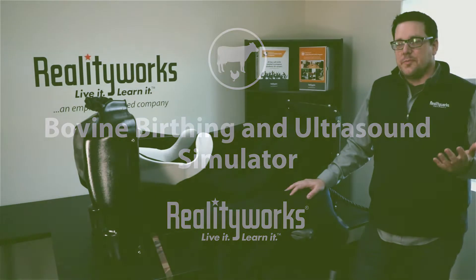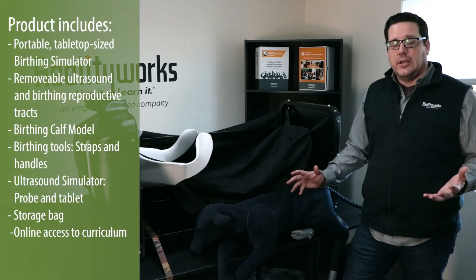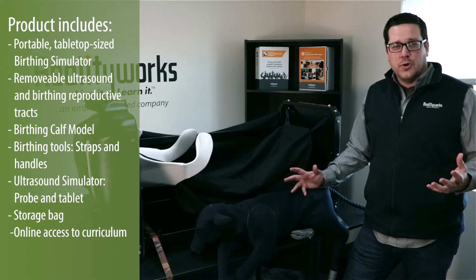We want to introduce our bovine birthing and ultrasound simulator. It's a great training tool for bovine birthing and also for teaching understanding of how ultrasound actually works for bovine.